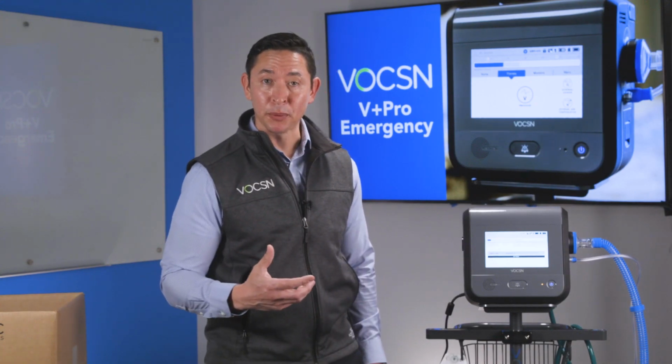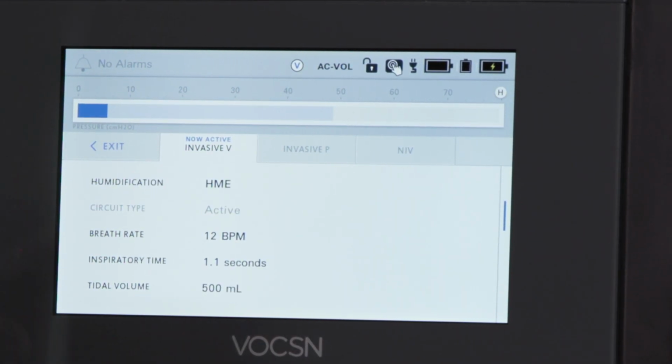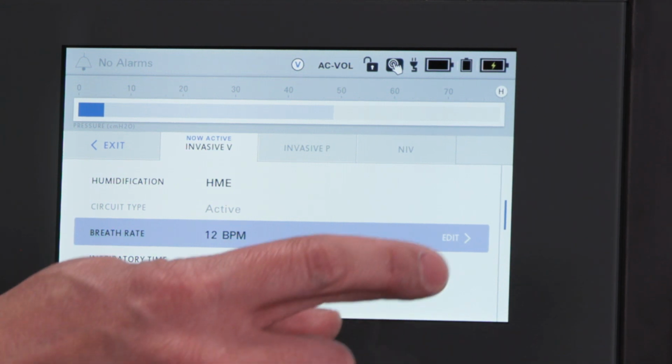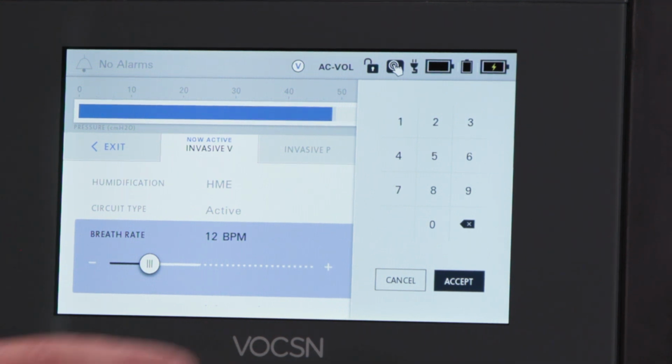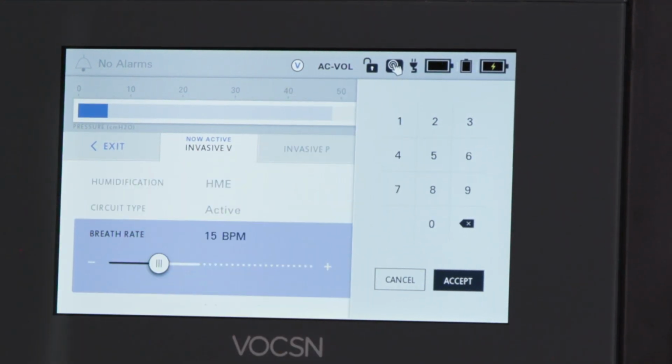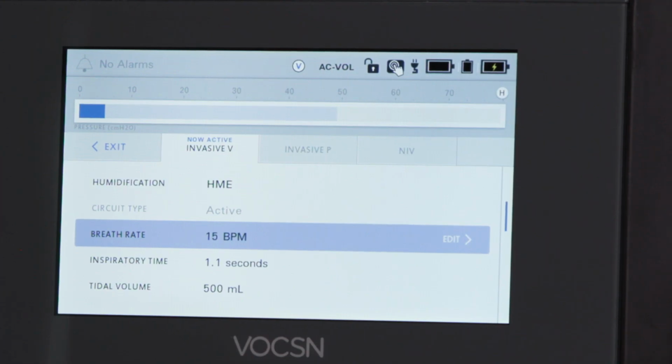Now maybe I want to change breath rate. So I'm simply going to scroll up until I see breath rate. I'm going to highlight breath rate. I'm going to edit. And maybe I want to go from a breath rate of 12 to a breath rate of 15. I'll simply type in 1-5 and hit accept. And so that's how we made a change. So now I can simply exit back out, which is on the left-hand side.